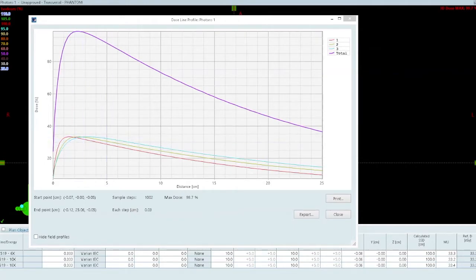And you can see the three of them each have a separate and distinct Dmax, and that makes sense. If I could zoom in, it's hard to tell right now, but if you could zoom in, you can see that my surface dose decreases as my energy increases. So a general rule is photon beam energy increases, skin dose or surface dose decreases. This is inverse to electrons, which as electron energy increases, surface dose increases.